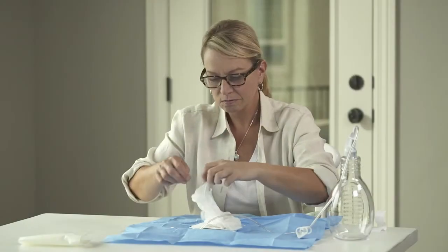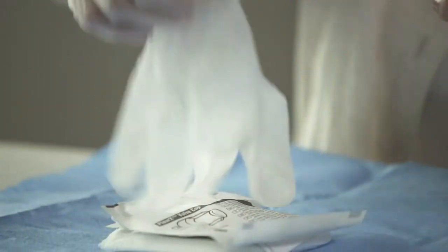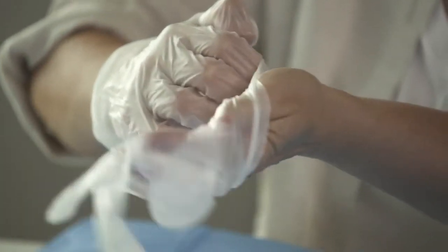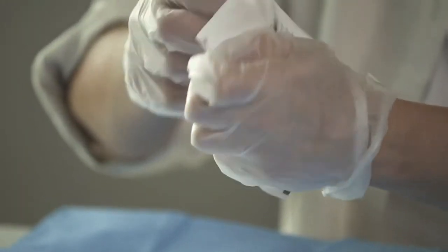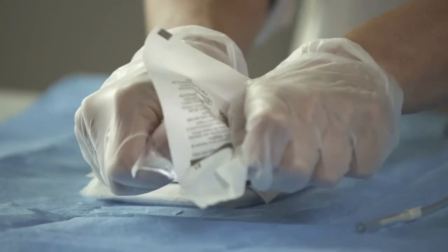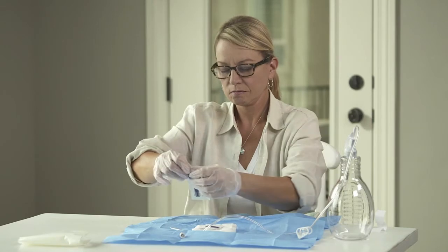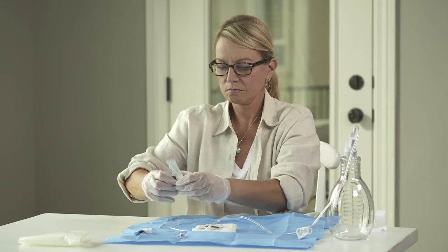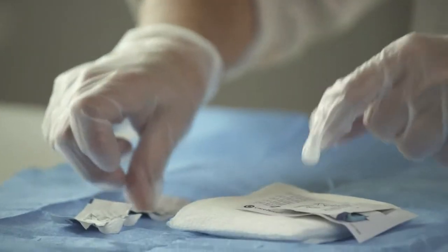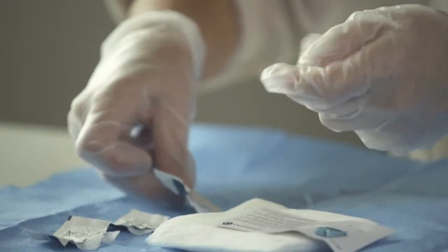Pick up a glove by the wrist and pull it on. Put on the second glove, holding it by the wrist. Both gloves fit either hand. Keep your gloves away from non-sterile items such as skin or clothing. Next, peel open the pouch with the valve cap and carefully let the cap fall onto the blue wrapping. You'll use the cap after you have finished draining. Finally, open all 3 alcohol pads and place them on the blue wrapping, but do not remove the pads from their pouches. You are now ready to prepare the drainage line and catheter for draining fluid.